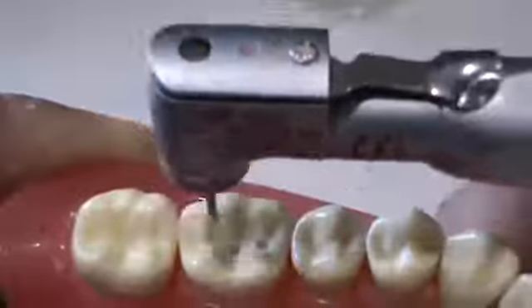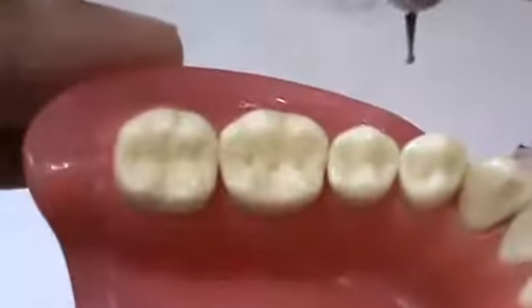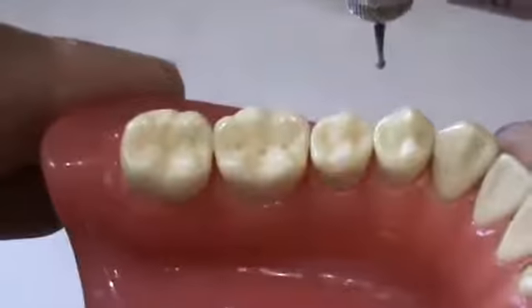And now we check the depth of all three holes. Now we have to remove the tooth structure between the holes.